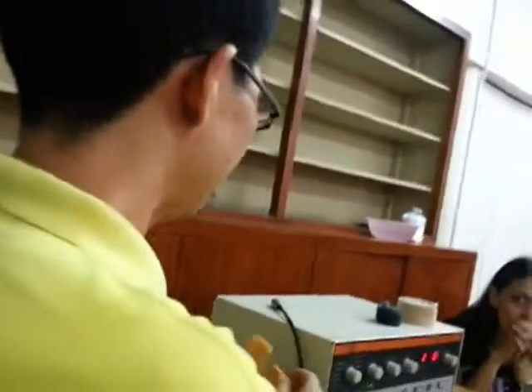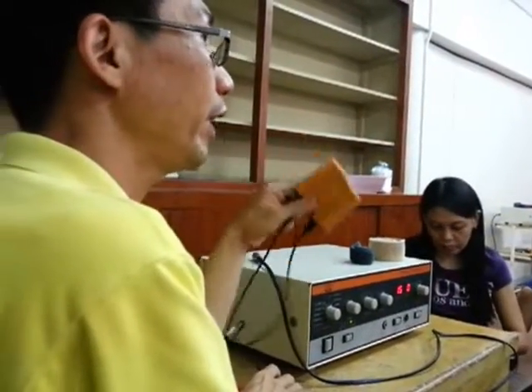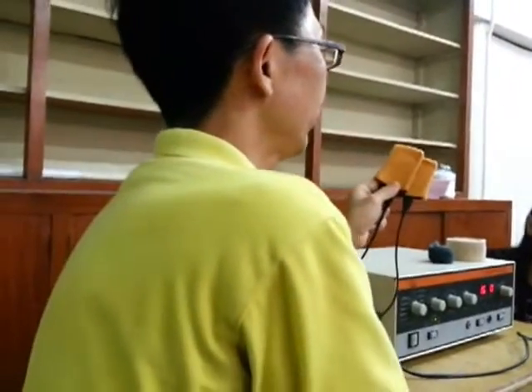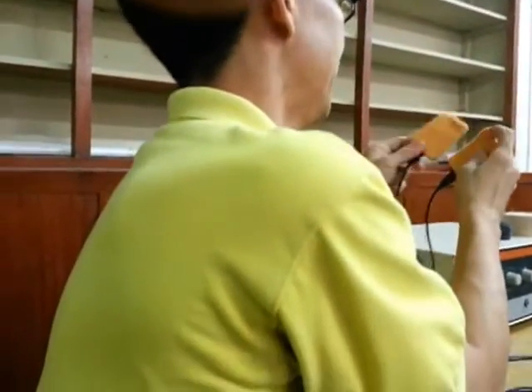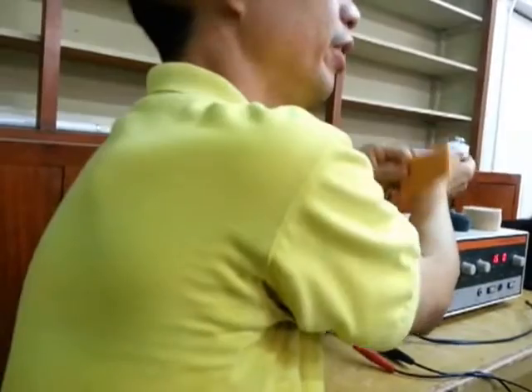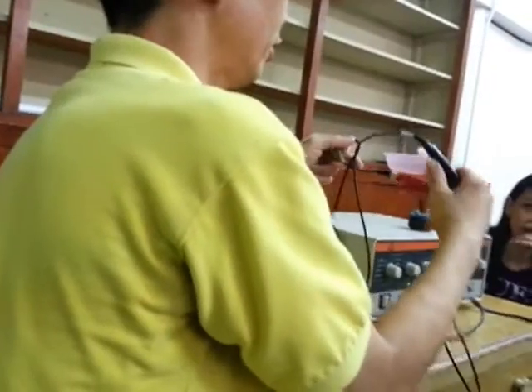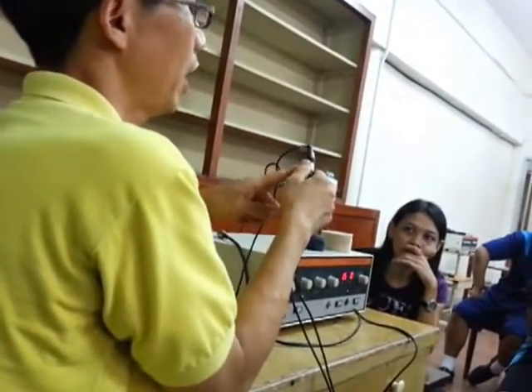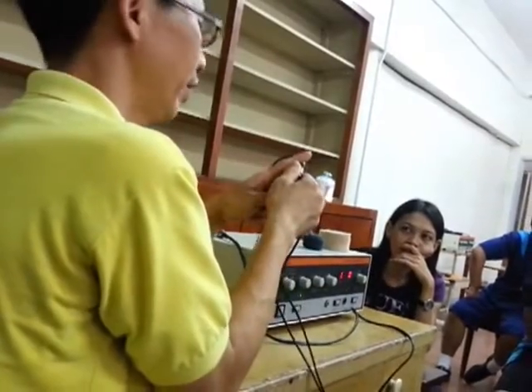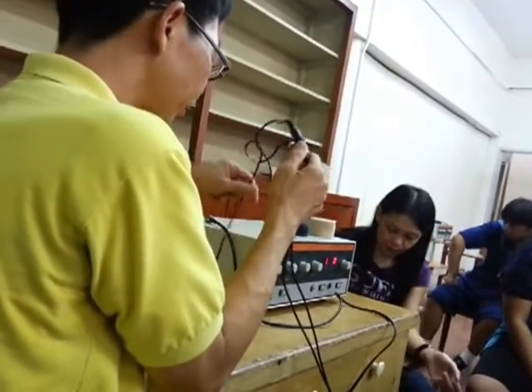Okay, so this would be placed on the muscle that you're going to stimulate. And with regards to the muscle that you're going to stimulate, you're going to place this within the muscle belly. So we don't apply this on the tendon, but on the muscle belly. You have here the color of the electrodes, so you have black and red. Usually, the universal color for black is the cathode or negative electrode, then red is the anode or positive electrode.